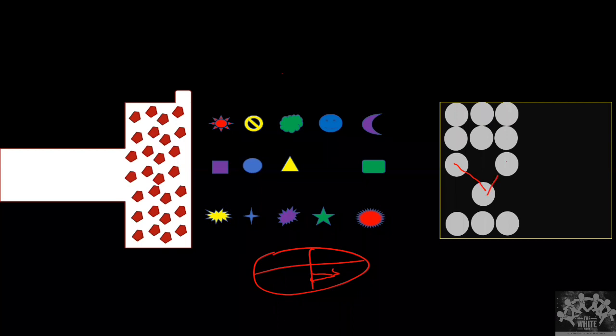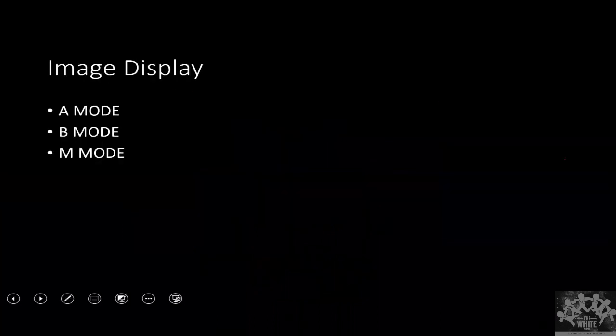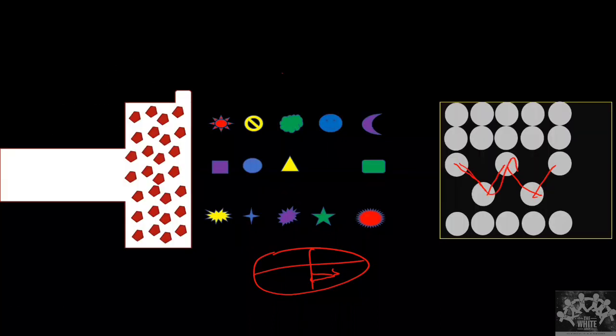Okay, the mitral valve has moved up. Now again, with time, the mitral valve comes down. Again I image, so again the mitral valve comes down. Again I image, and the mitral valve goes up. Then the same thing, I continue. So I get an image where we can see the moving structure is changing like this, but the non-moving structure appears very linear. Okay, so this is how I see how the structure moves.